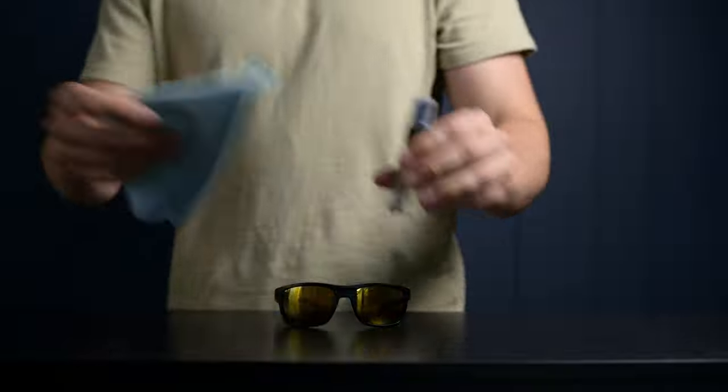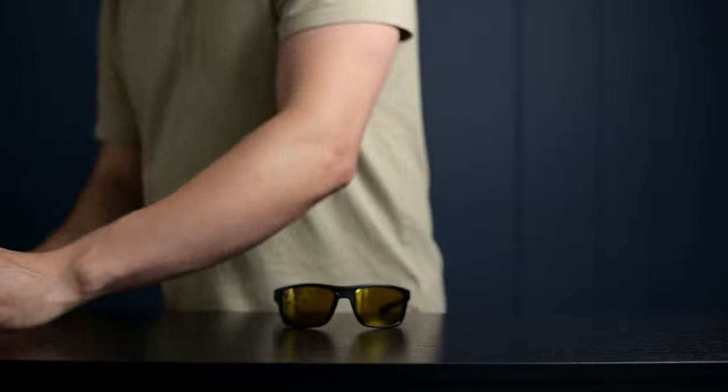Now that we have the science out of the way, let's get into what this means for you. Let's take a look at one of the frames available on our store. We've got some proper clean materials for the lenses, but we're not going to be using those today — what we're going to be doing is trying to scratch these using the table.